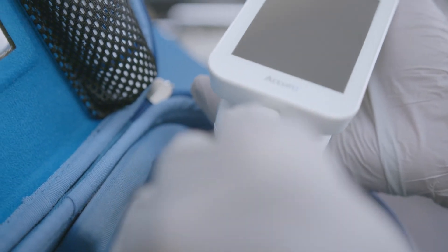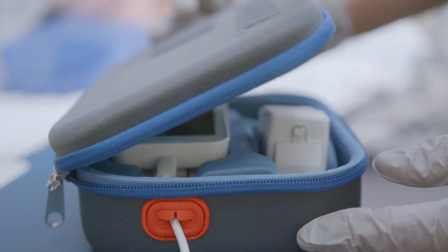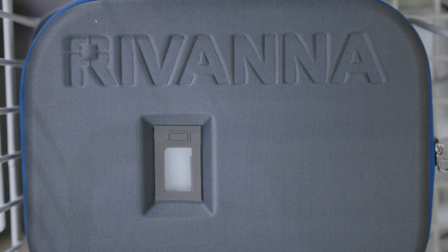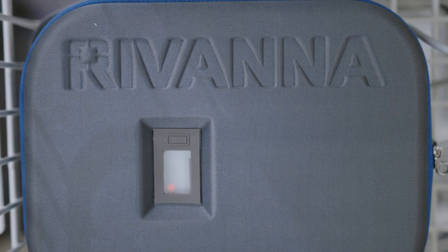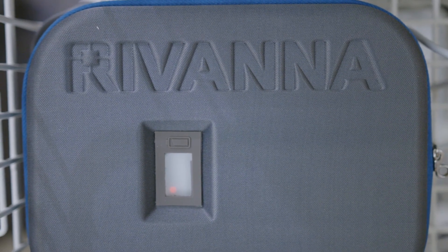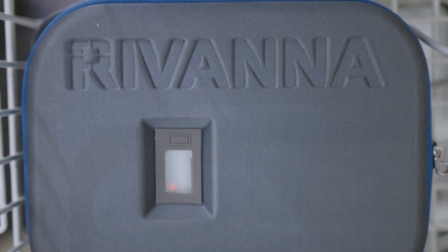The Acuro may be charged while in the case by using the orange gasket to thread the charging cord. You can confirm the Acuro is charging using the orange charging indicator light, which can be viewed through the window of the carrying case. The blue light indicates the Acuro is on.